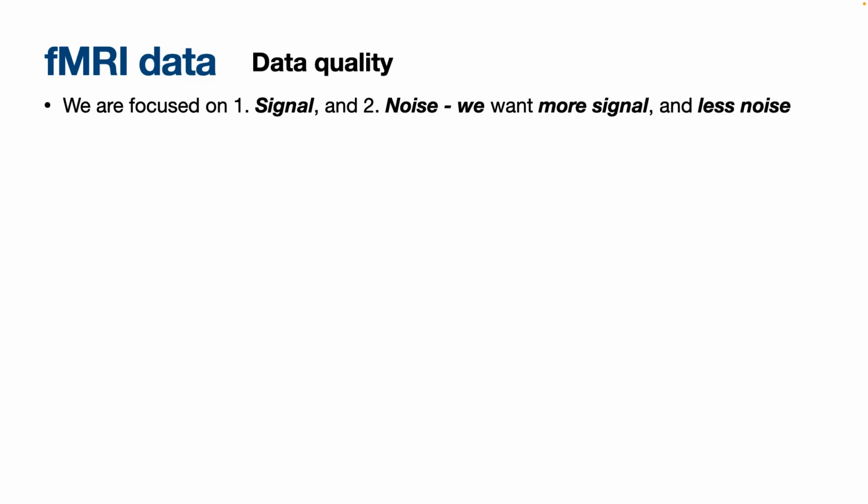So what we care about is signals, right? We want to get signals from the brain, something, even though it's blood, that is going to relate to the neural activation so that we can actually look at the machinery that produces our minds inside a living human brain. Right? That's what we want. Those are the signals that we're interested in. But like I just showed you, there's a lot of noise. There is heartbeat stuff happening. I don't want that. It has to go. And so our eternal battle in analyzing fMRI data is to separate the signal from the noise. To be able to say, this is noise, I don't want it. This is signal, what does it look like? But of course, no one knows where the boundary between signal and noise is.